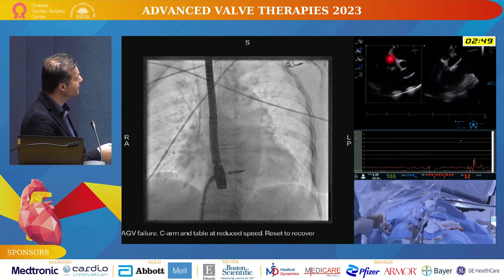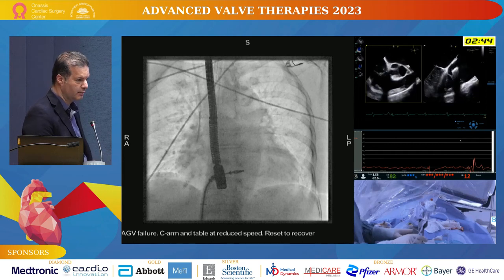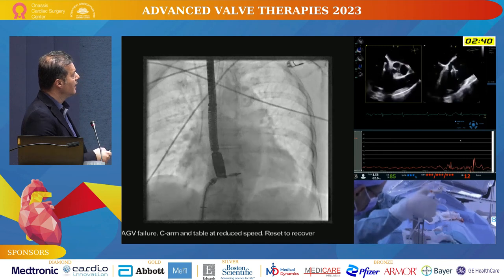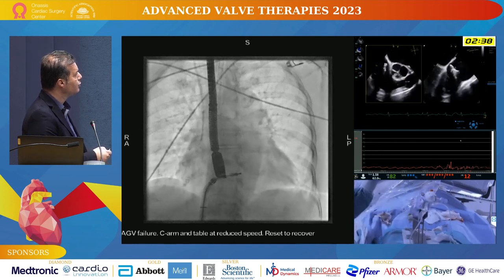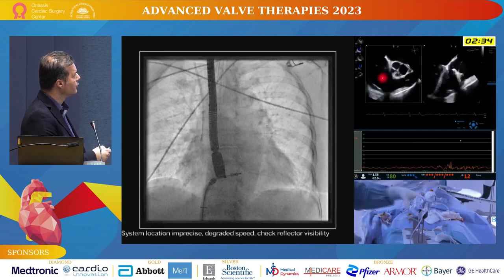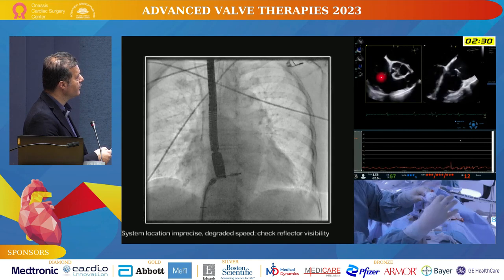You can see here. What we want now, and that's the most difficult part, is the imaging. Imaging has to be pristine. We have to be precise, and we make every effort to get good imaging. So we are trying to target the location we're most interested in, where the color is.